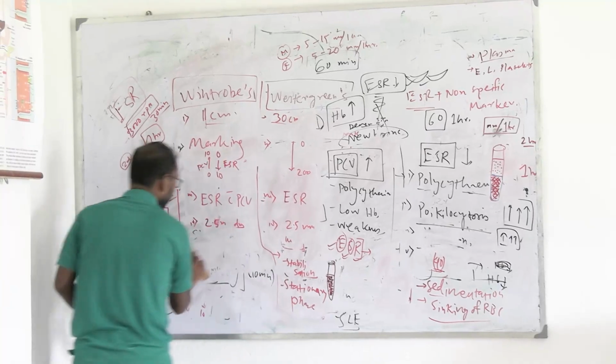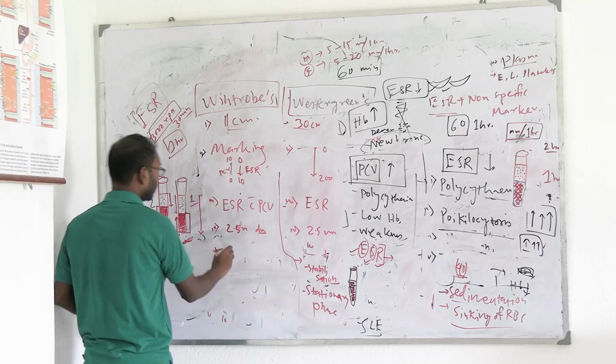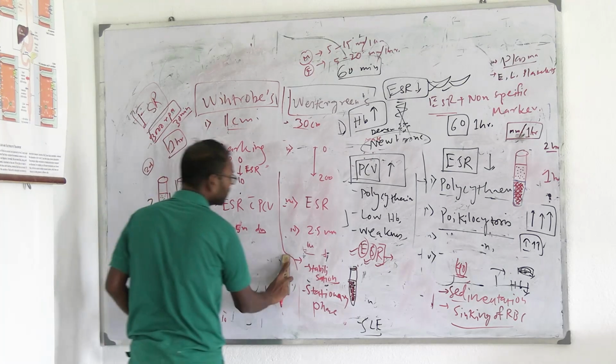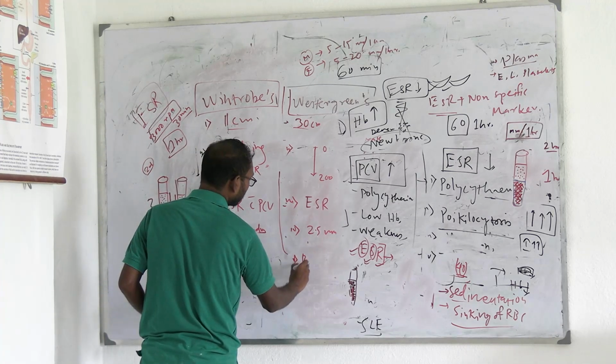Okay, so there is another point, the difference in structure. What is the difference in structure? Point 5 is, these are actually one end open tubes, but these are open at both ends.